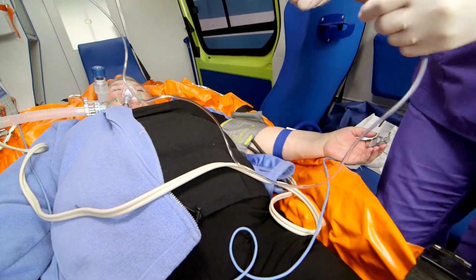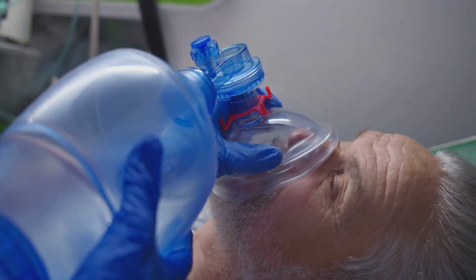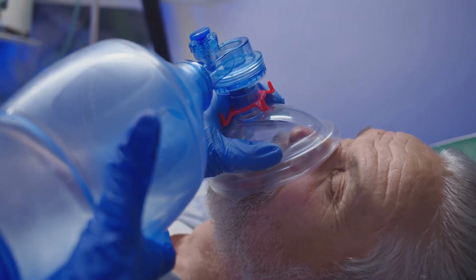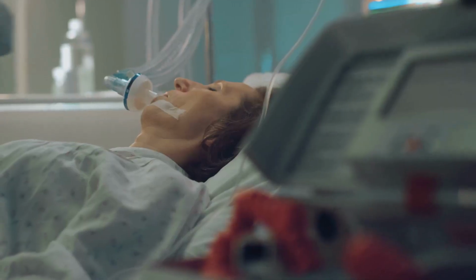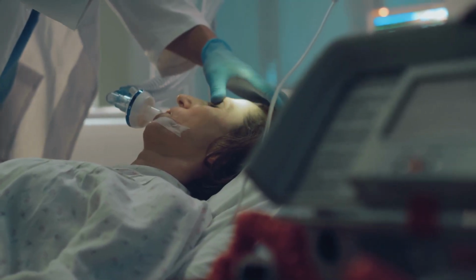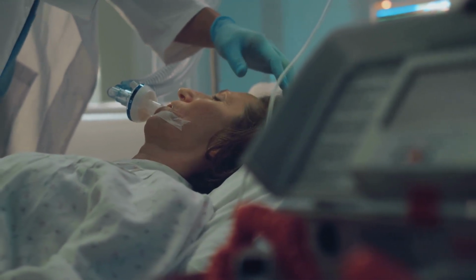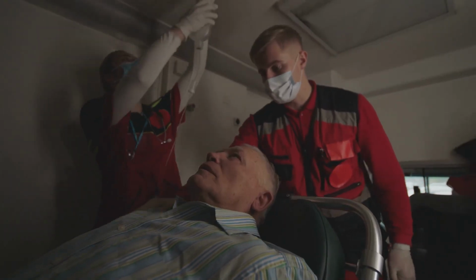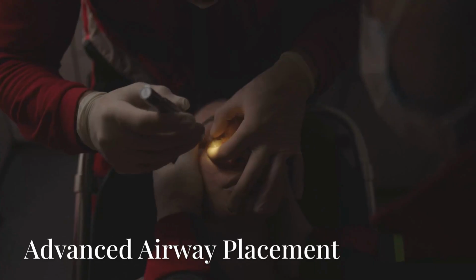Deliver oxygen based on the patient's condition. For critical patients, use a non-rebreather or BVM with 15 liters per minute. For patients with chronic respiratory conditions, titrate to maintain an oxygen saturation of 90 to 94%. Avoid hyperoxia in certain situations like stroke and post-resuscitation.